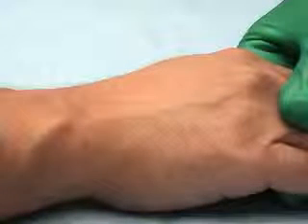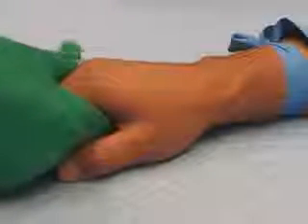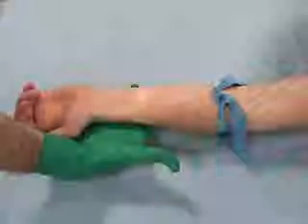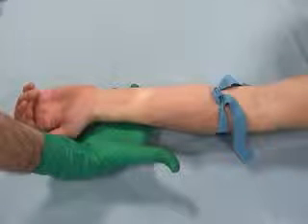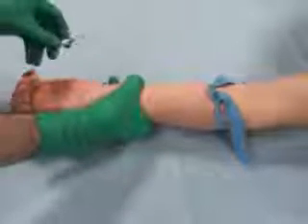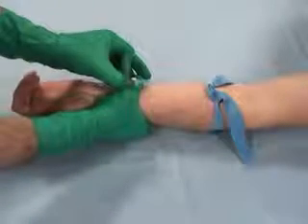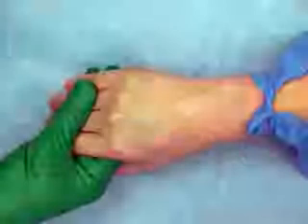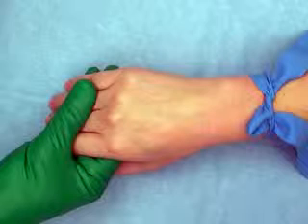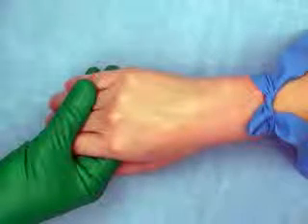If the catheter is placed in the dorsum of the hand, grasp the patient's hand with your non-dominant hand, fingers beneath the palm. Pull downward to flex the wrist, and use your thumb to keep the skin taut. If a forearm vein is selected, use your non-dominant hand to encircle the patient's arm. Place your thumb on the skin distal to the venipuncture site and pull down. Regardless of the venipuncture site, always maintain a firm grip on the patient's hand throughout the procedure.